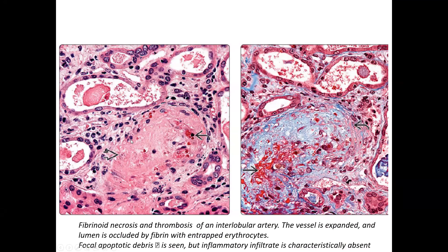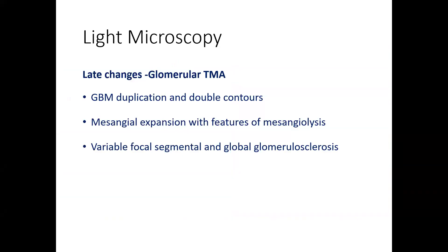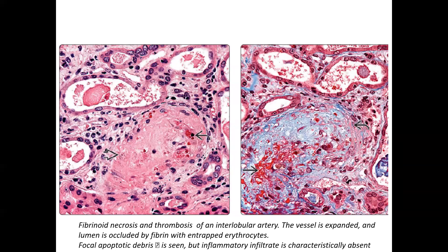In the interlobular artery, fibrin is present in the lumen and wall with entrapped erythrocytes. The characteristic observation here is that although fibrin is present in the lumen and wall, there is no inflammation in the wall. If you find inflammation in the arterial wall, you should exclude vasculitis before considering thrombotic microangiopathy. These are the early-to-subacute changes of TMA.